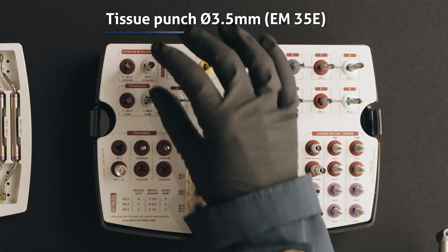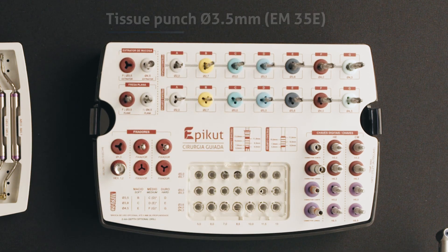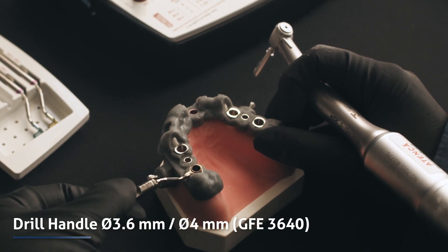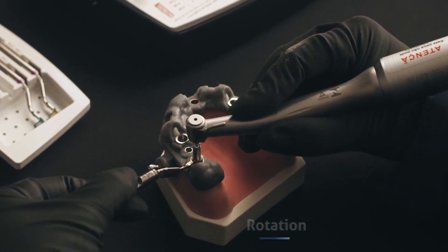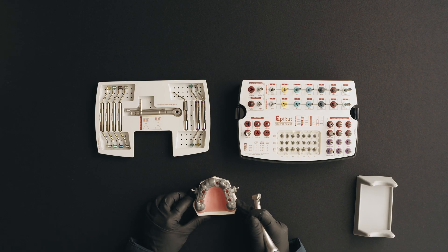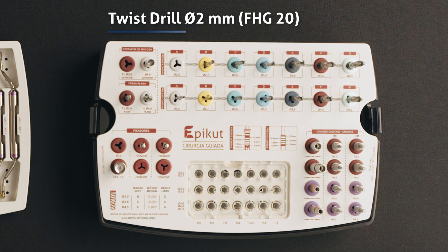Now, select the tissue punch to simplify the drilling sequence. To use it, insert the regular sleeve drill handle of the tissue punch. To start the drilling sequence, select the 2 millimeters diameter twist drill.